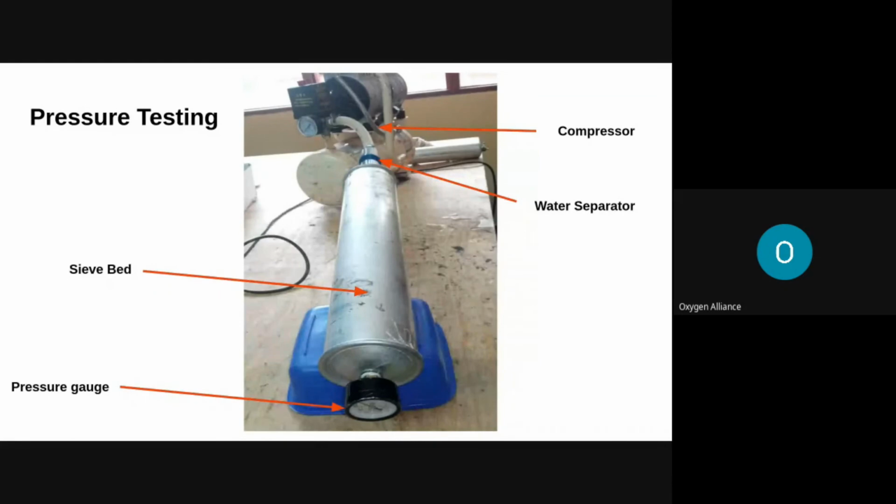When closing the sieve bed, it's very tricky because the spring is always forcing you up. Sometimes if it's stuck at an angle, that can create some leakages because the O-ring itself is also not sitting well. And another thing I think I already mentioned, it's especially in an AirSep, a model where we close with a nut.